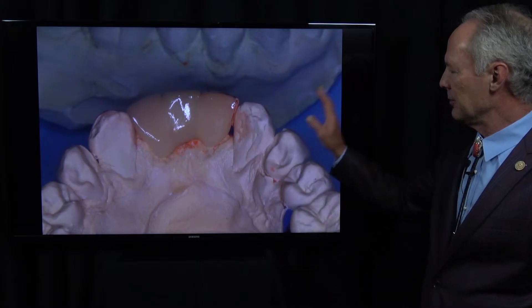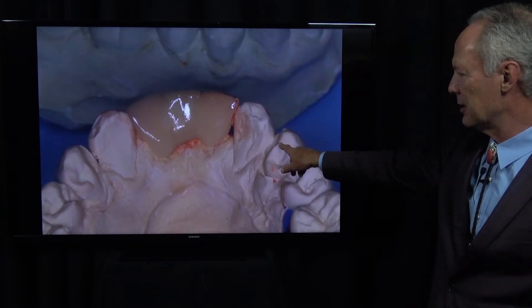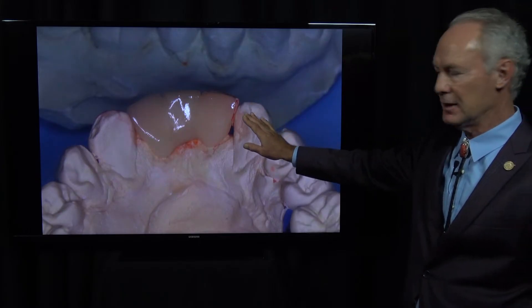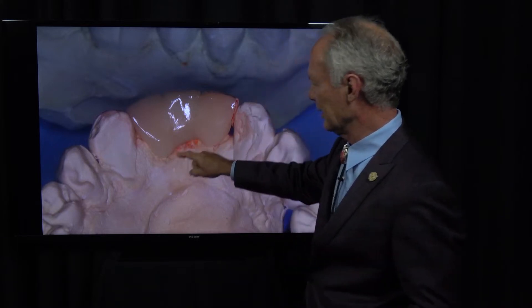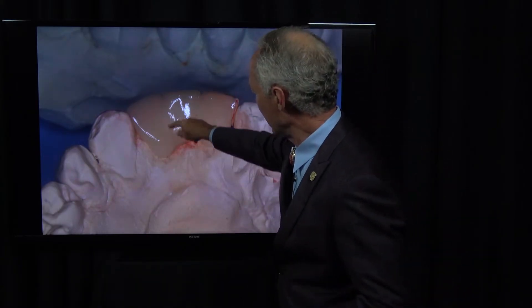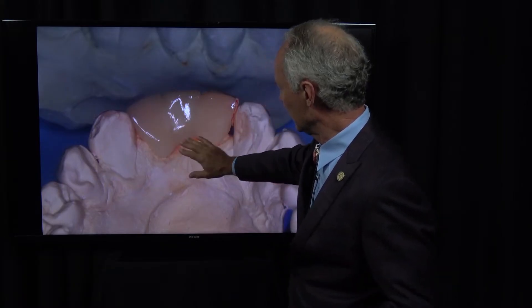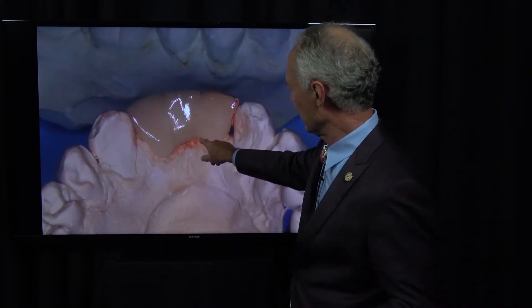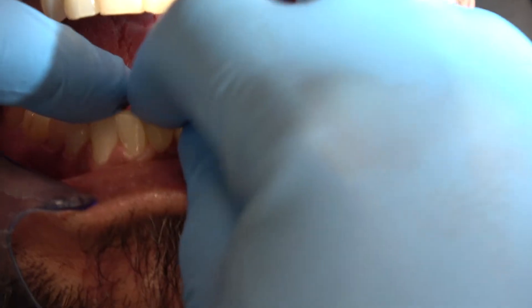This is an Emax lithium disilicate-to-zirconium restoration. The framework is zirconium and the veneered part is Emax or lithium disilicate. Notice I want the lingual or palatal aspect of the bridge to be flat. Don't make big sluice ways or interproximal areas on the lingual because it's not in an aesthetic zone and it's just a food trap. On the lingual, make it flat so they can get floss underneath and clean it without trapping food.